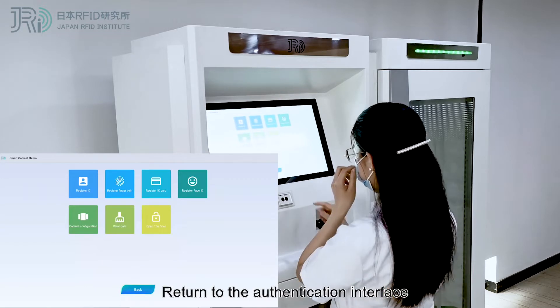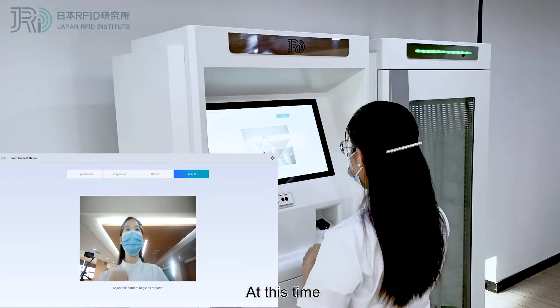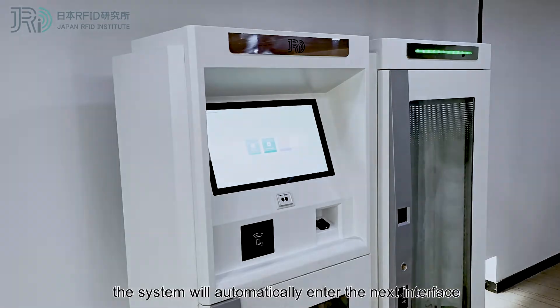the recognition box will turn green. Return to the authentication interface. As the face verification is done, the system will automatically enter the next interface.